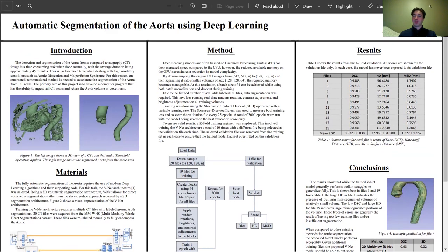Those scores can be seen up here in the results section. We can see the file number and see the dice scores that each one achieved, the Hausdorff distances, and the mean surface distances along with their average and standard deviation at the bottom.